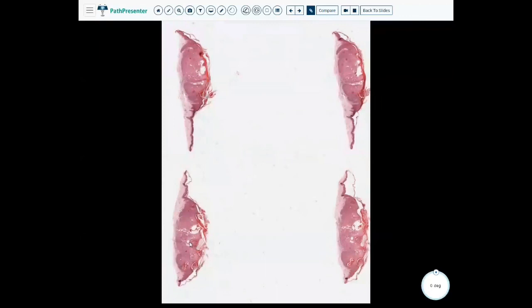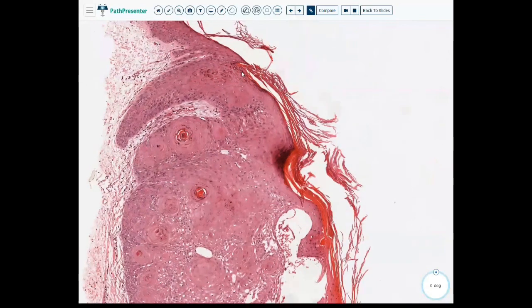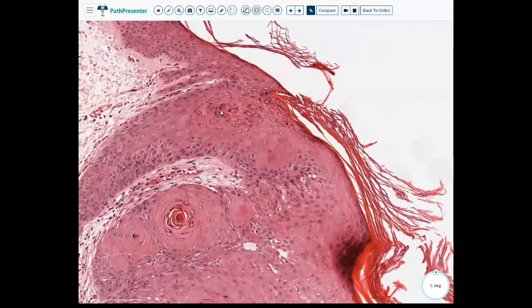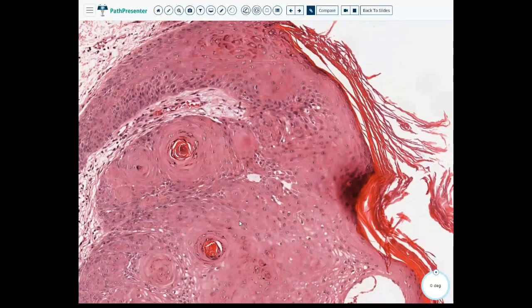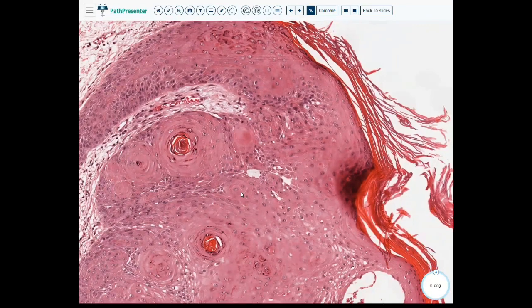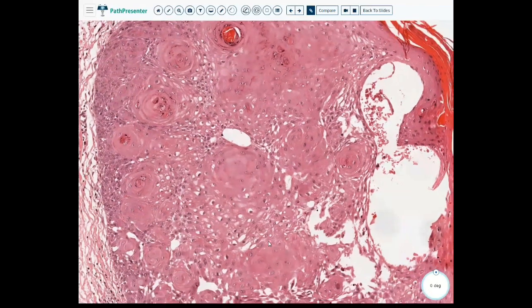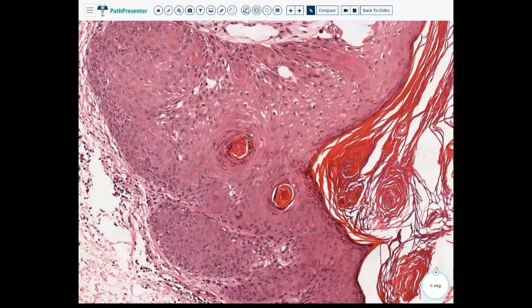Case three. It looks like we have two pieces, same cut, and kind of the same thing going on. We have this really prominent acanthosis. The granular layer looks a little more eosinophilic maybe than basophilic — you can tell it definitely stands out and is in the correct place. We do have some tangential sectioning as well as some spongiosis. This is really good for pseudohorn cysts here.